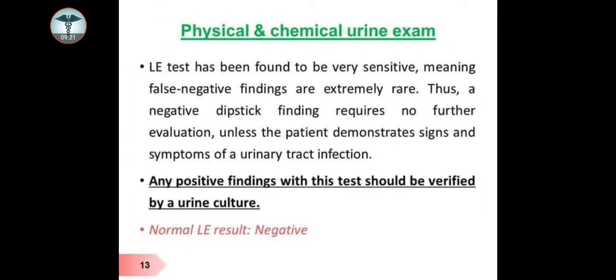The leukocyte esterase test has been found to be very sensitive, meaning that false negative findings are extremely rare. Thus, a negative test finding requires no further evaluation unless the patient demonstrates signs and symptoms of urinary tract infection. Any positive finding with this test should be verified by urine culture. Normally, leukocyte esterase is not present in the urine, i.e., it is negative.